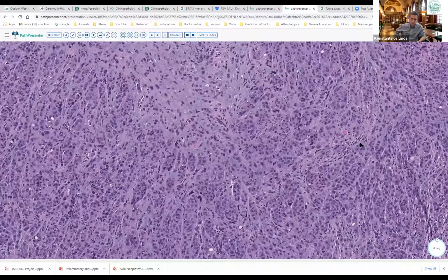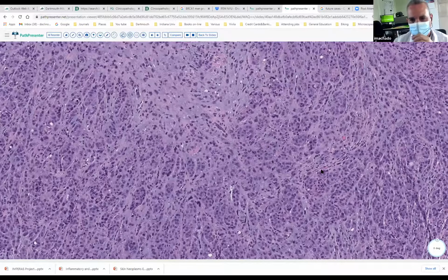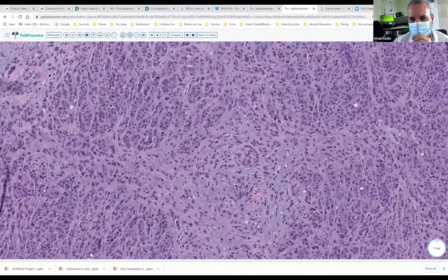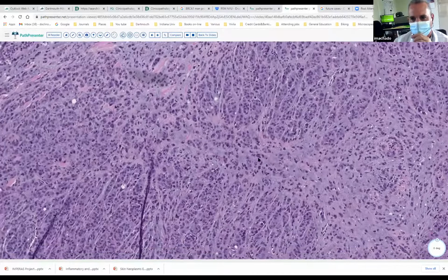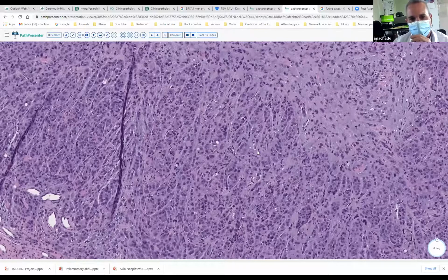That's a very good thought. Any other thoughts? Yeah, I agree with Enrique's suggestion. I would also include neuroendocrine markers, maybe INSM1 for excluding extraskeletal chondrosarcoma. And maybe we should also exclude epithelioid synovial sarcoma, which could be a possibility because there is a cellular variant of synovial sarcoma that may show this epithelioid morphology.